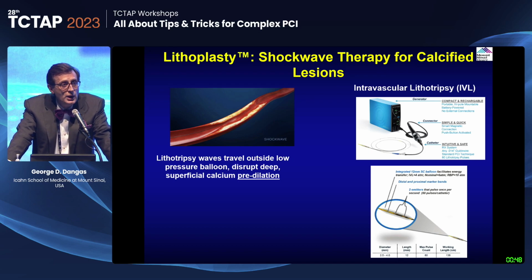Lithotripsy is a balloon, so maybe a little bulkier than the usual balloon, but it is a balloon nonetheless and can be inflated to a few atmospheres, and then it's activated and radiates some pulses around that fracture the calcium. You can do up to 8 inflations of 10 seconds each, and ultimately you get some good expansion, and it comes in different sizes of balloons.